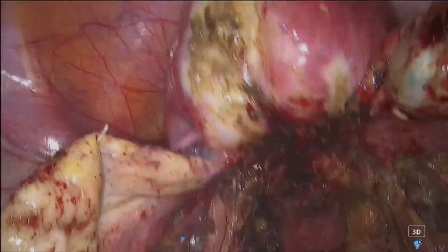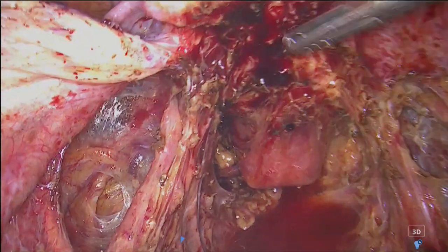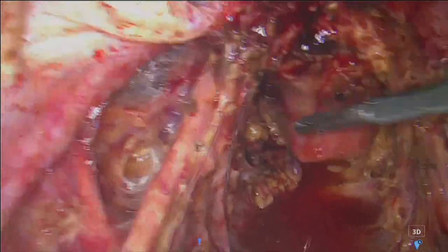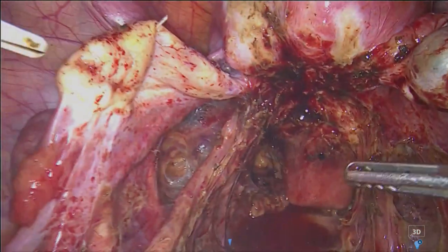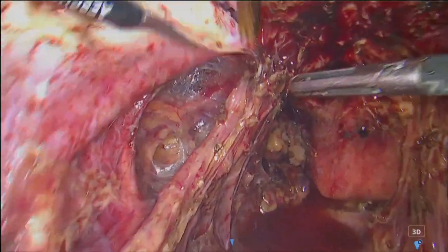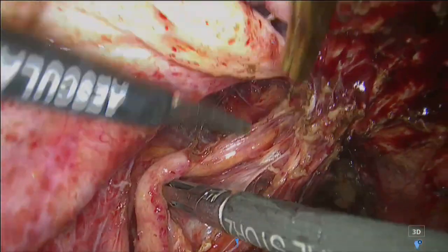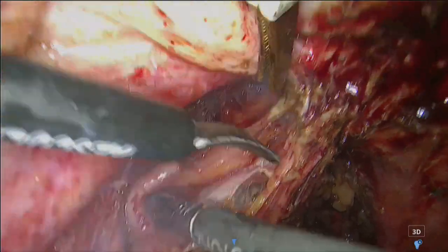It's better to do now the retrocervical nodule because we have more vision posteriorly, and then at the end the anastomosis. So you see, this is very good usually for anatomy, because we can check everything in the parametrial area. So we start to do this so-called parametrectomy on the left side.